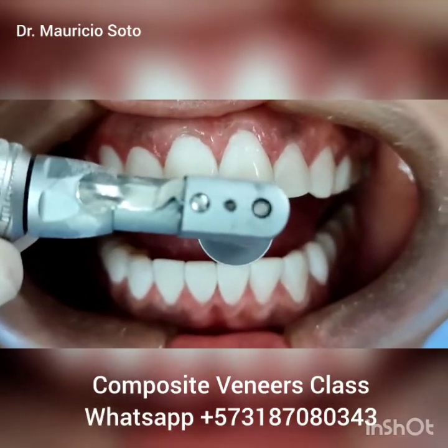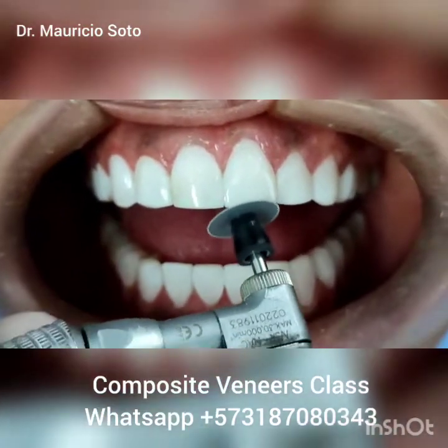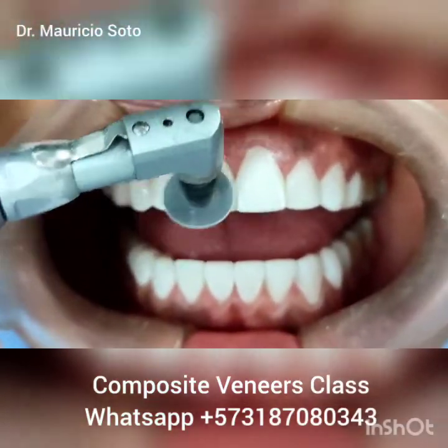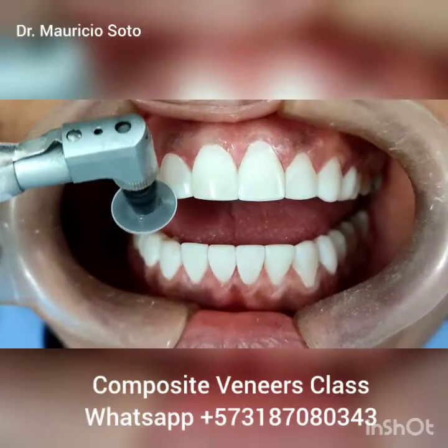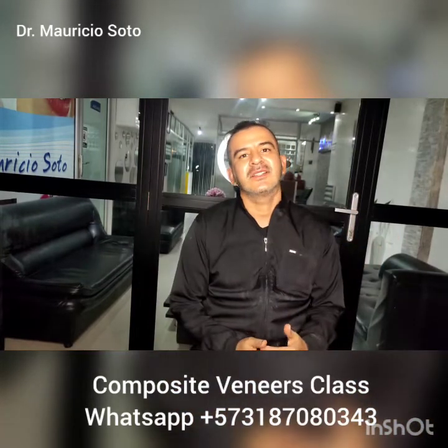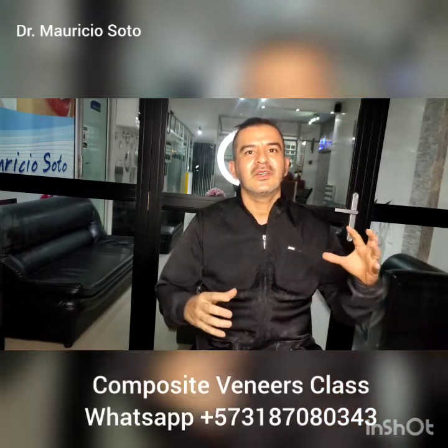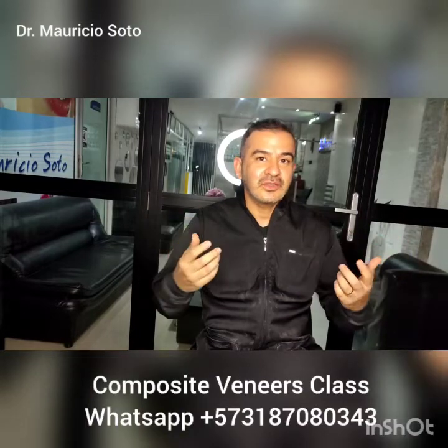I start the finishing by removing the excess of composite from the front and from the edge of the teeth to adjust the size and shape of the teeth to obtain a nice smile. This is a Shuffle Super Snap Black disc. Do this with care. The first step in finishing is to adjust the size of the veneers — adjust the size with the face and with the smile. We remove composite until we have a perfect size for the smile, a perfect size that looks good in the face.